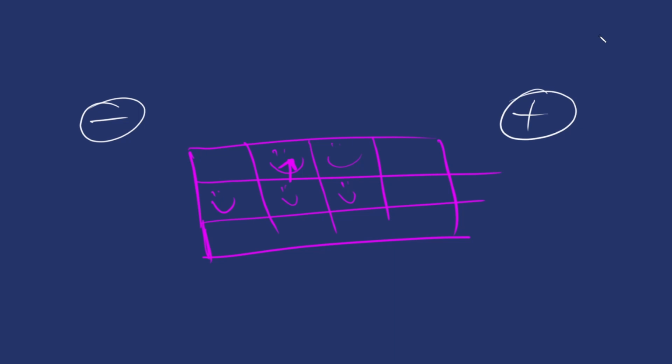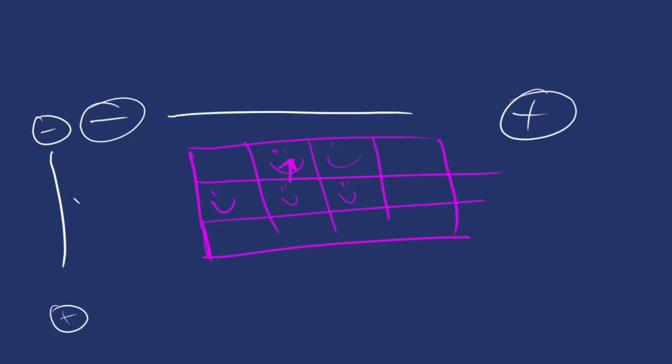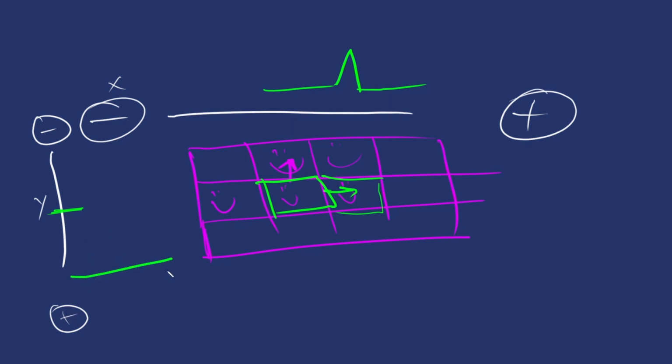So the way we change this up is we set up another electrode, right? Because these have to be in pairs. We can set up another one here. So this one is looking like this. So that's become our Y, and this is our X. Just like looking at a grid in mathematics, right? So now, if we have this guy, and he's going left to right, for this first one here, up along the top, because it's moving towards the X, it gets a positive deflection. But because it's going this way, for this one here, right, there's no change in that one. It's not going towards a positive. So this one sees nothing.